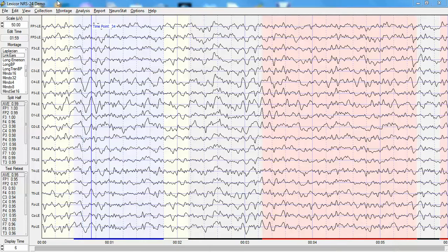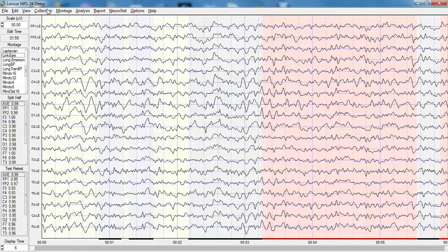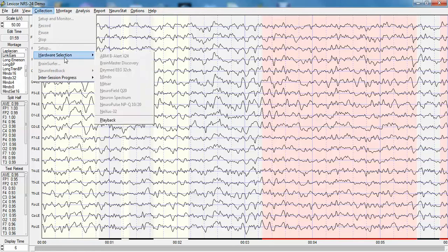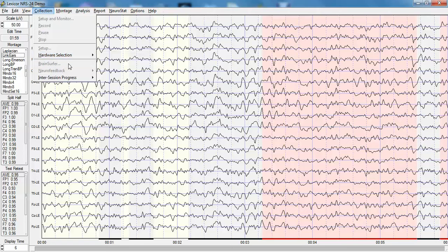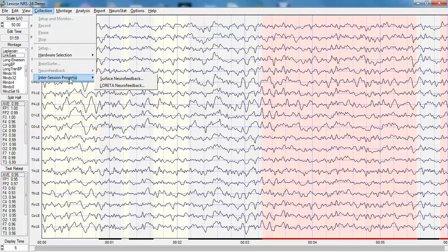That's an example of just one tool among many in NeuroGuide. Now I'm returning to edit data. One also can collect EEG from a variety of different amplifiers as well as play back a record that you already have recorded and then evaluate it using what is called brain surfer, which is a three-dimensional imaging routine of problem areas and the connections between problem areas. One can also be involved with neurofeedback or surface biofeedback and LORETA biofeedback and one can evaluate the intersession progress.